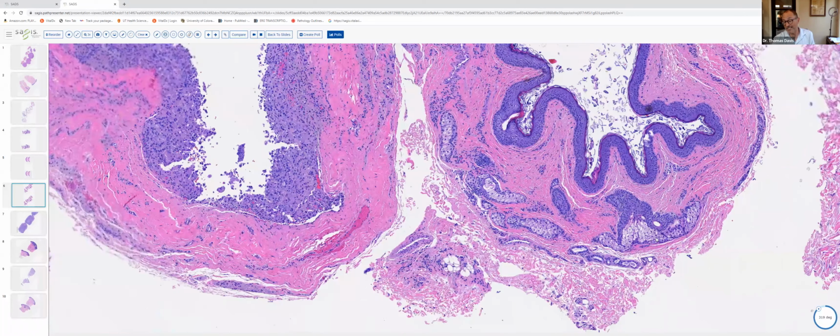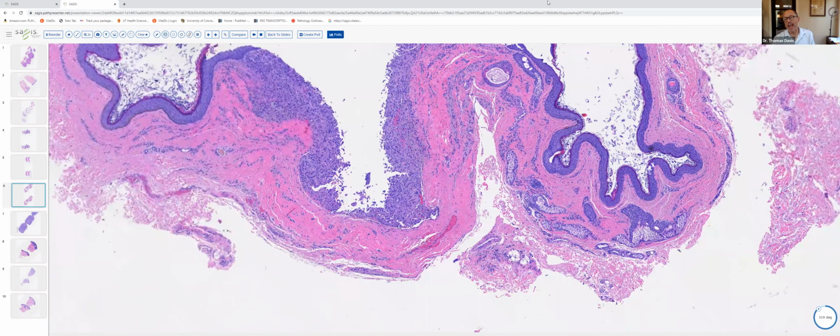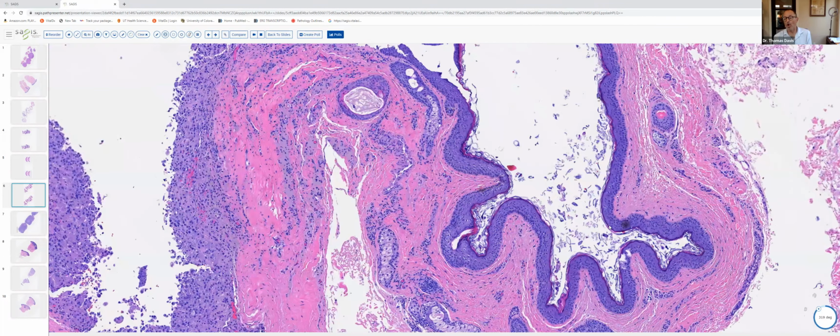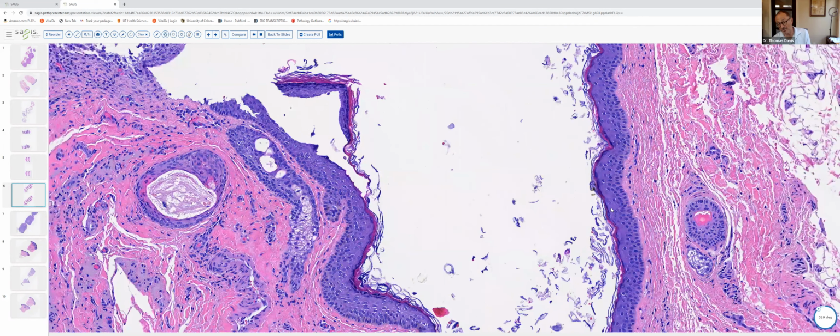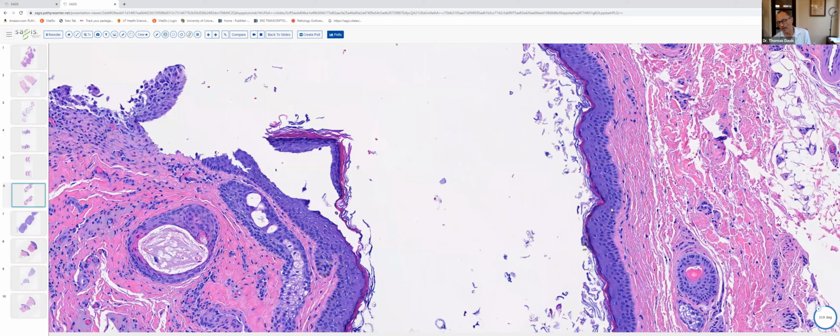Occasionally, one can see dermoid cyst in which areas of the cyst resemble a steatocystoma. Steatocystomas, or sebaceous duct cysts, as you remember, are also lined by stratified squamous epithelium, and they can contain sebaceous elements in their wall. However, the lining is a little different in a steatocystoma. In steatocystoma, one does not get interposition of a granular layer. The luminal aspect of the cyst has a scalloped border, and there's a thin eosinophilic cuticle along the luminal aspect. And occasionally one can see that type of differentiation focally in a dermoid cyst.